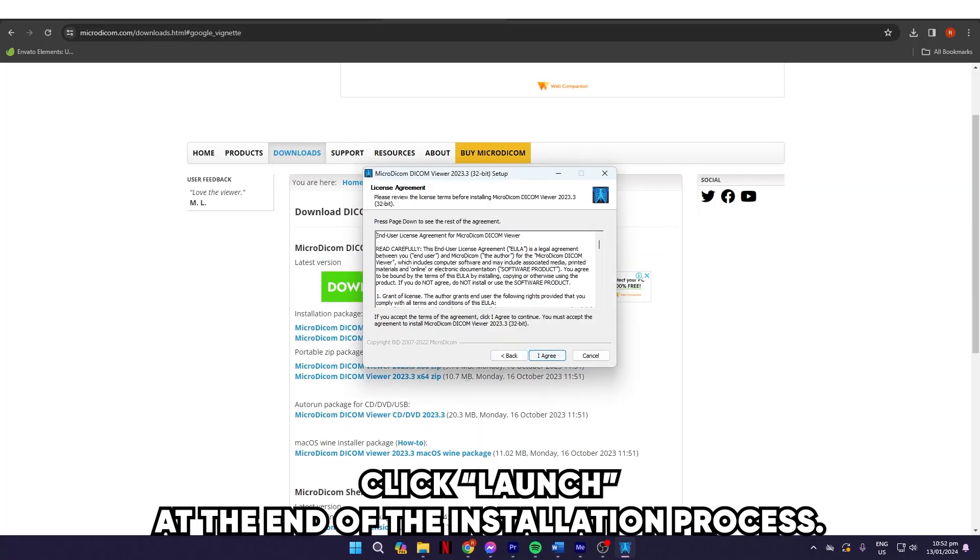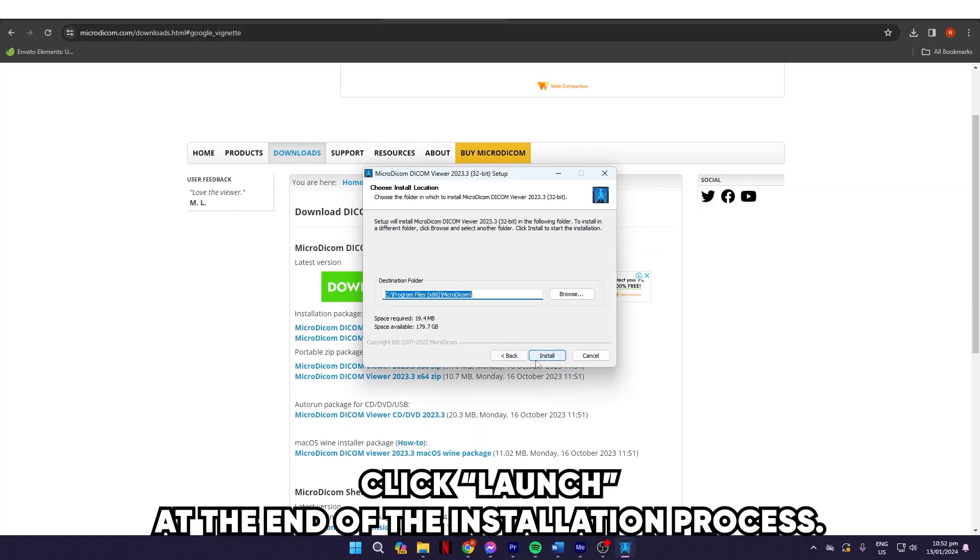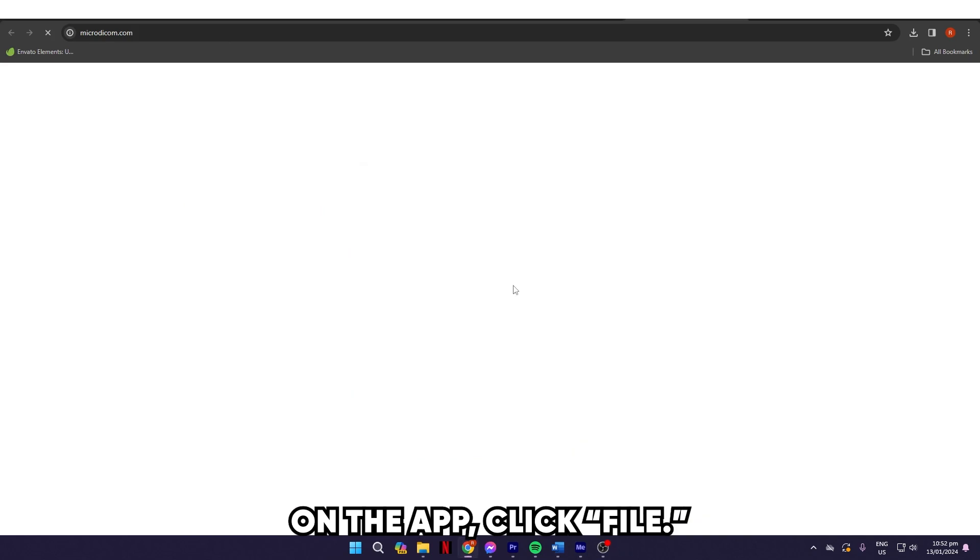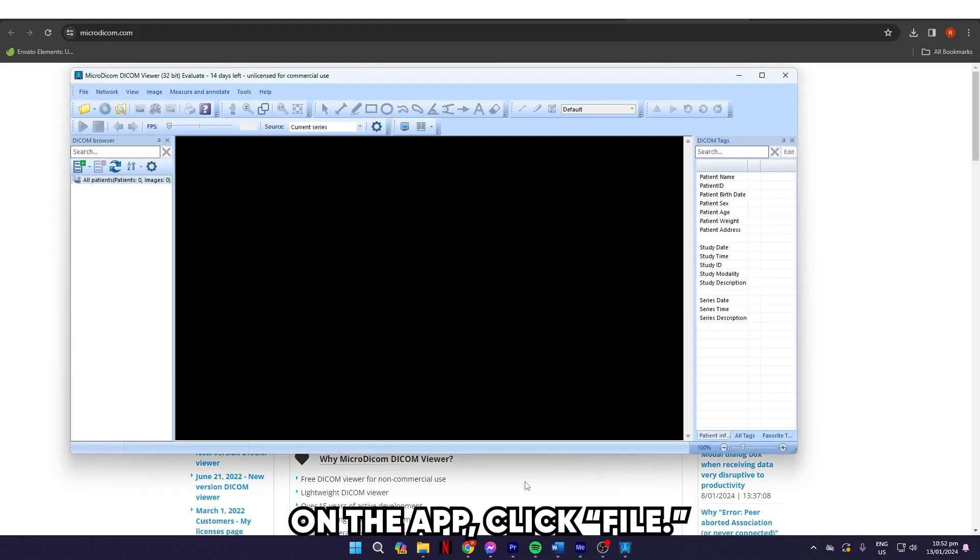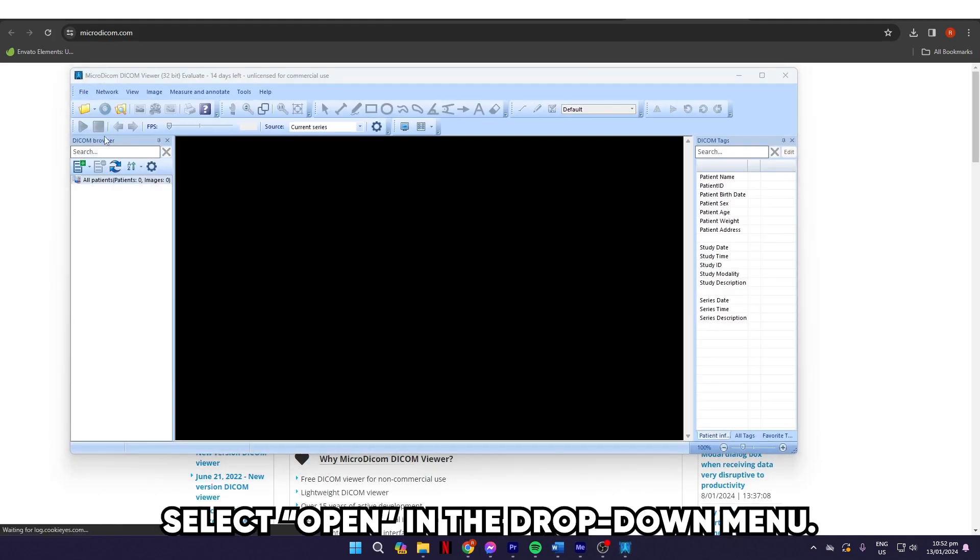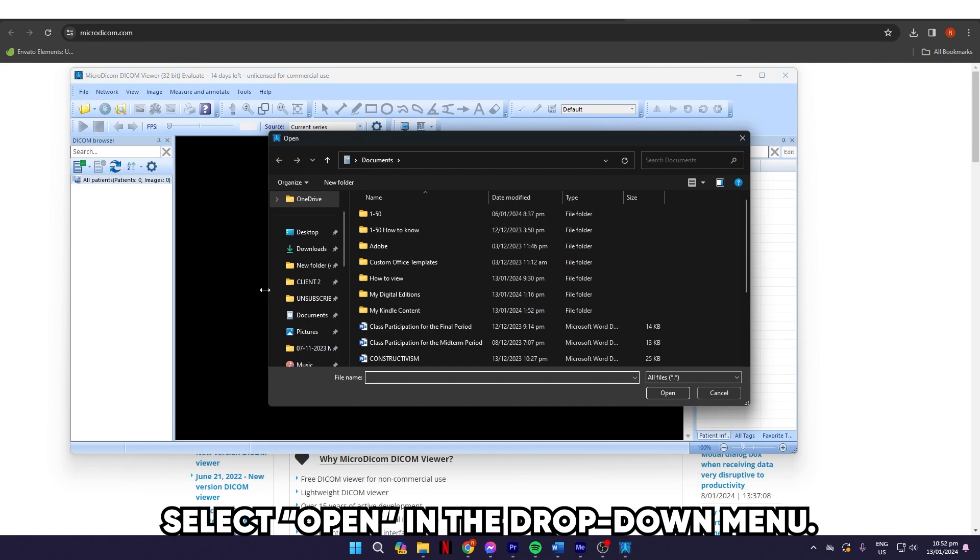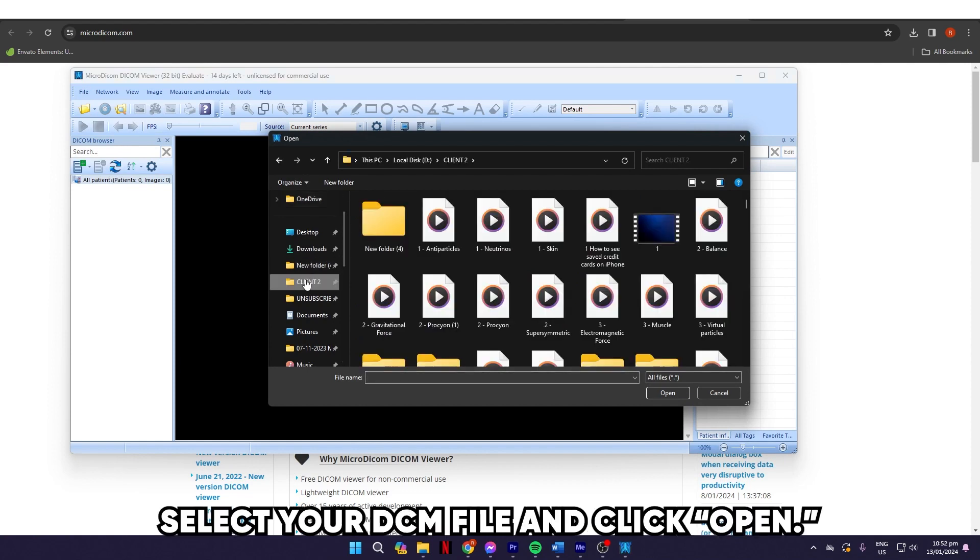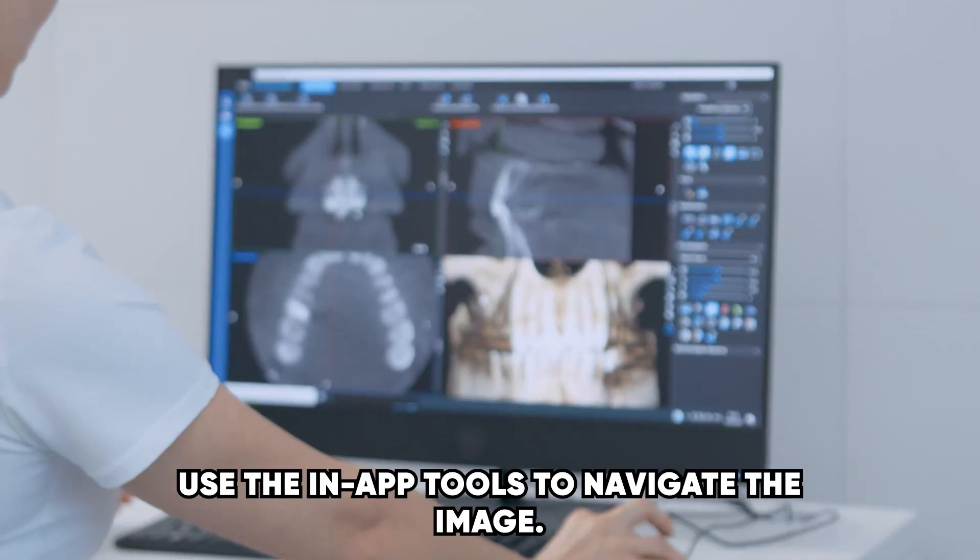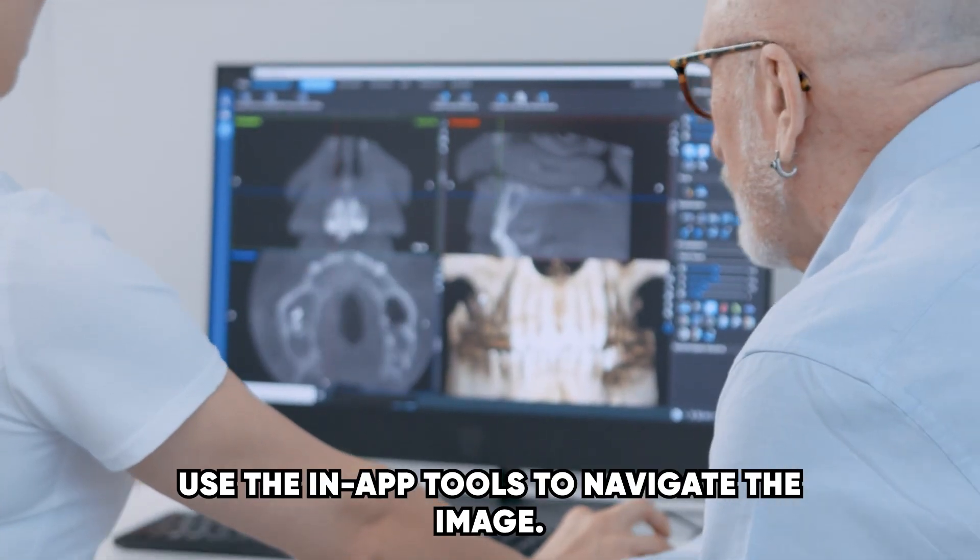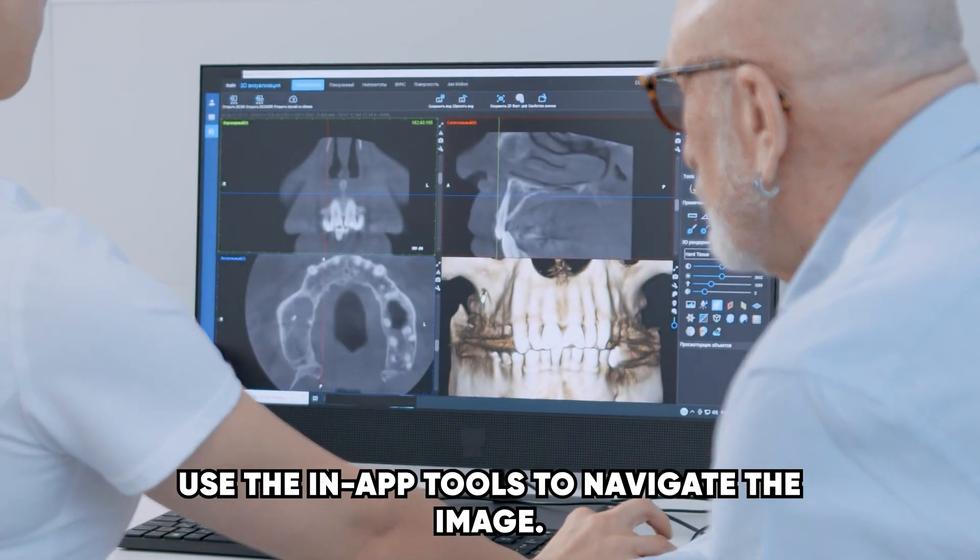Click Launch at the end of the installation process. On the app, click File. Select Open in the drop-down menu. On the next window, select your DCM file and click Open. Use the in-app tools to navigate the image.